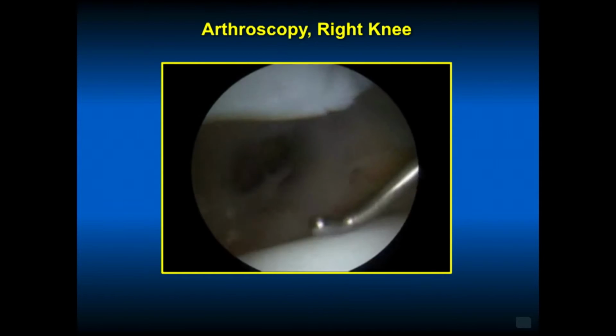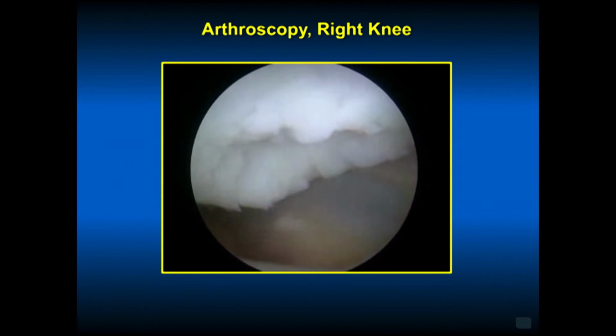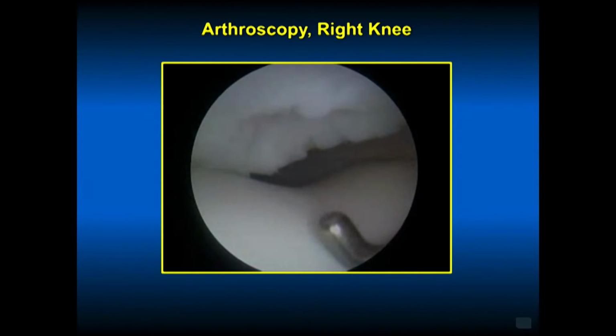Document the size, look at her patellar tracking. Her patellar tracking was central. No open procedure or realignment was done or necessary, and she did well following this arthroscopy. No recurrent dislocations, had full range of motion.